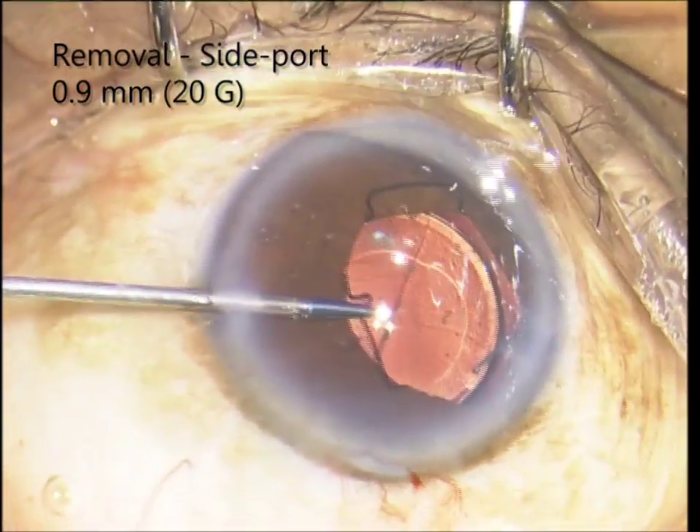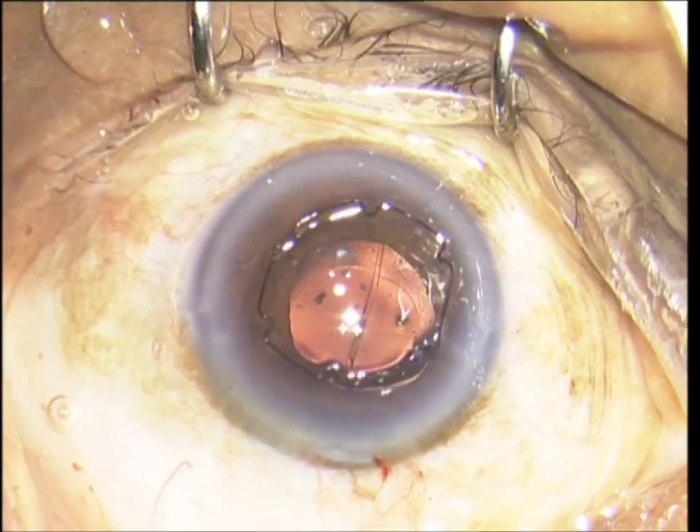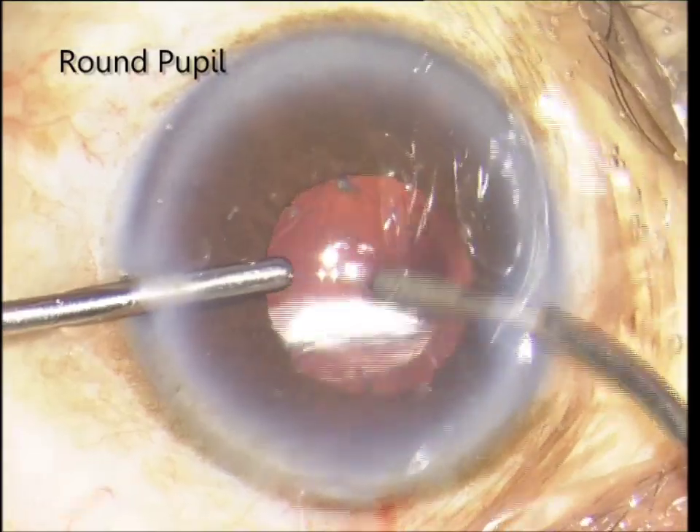2 notches are disengaged and the device is simply pulled out of a side port or phaco incision. The device retains its shape and integrity and we have a round pupil.